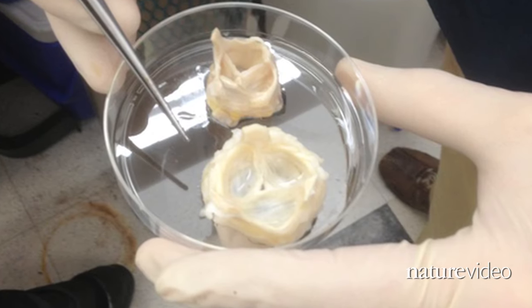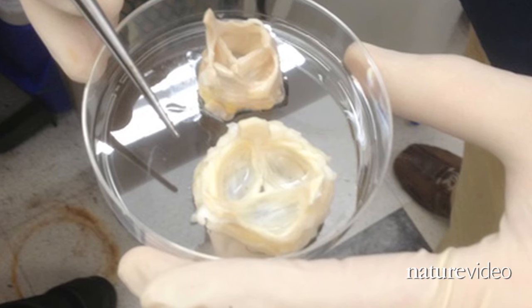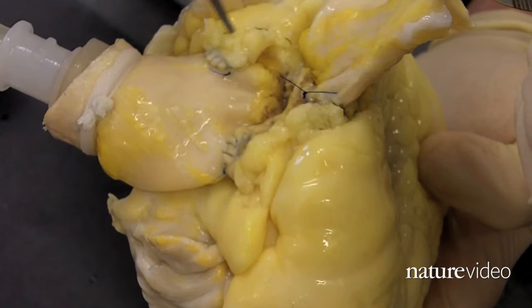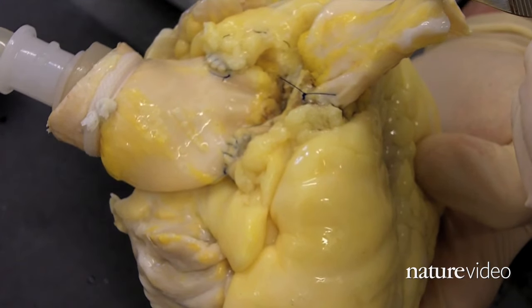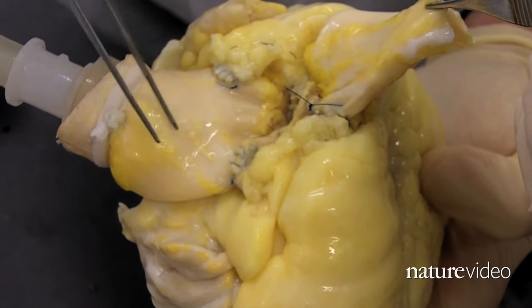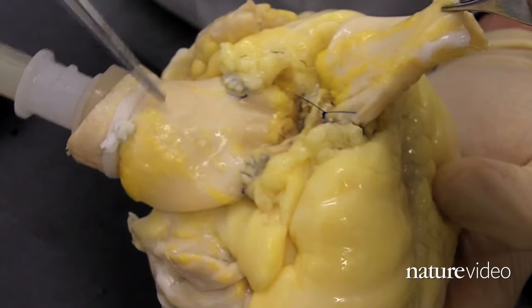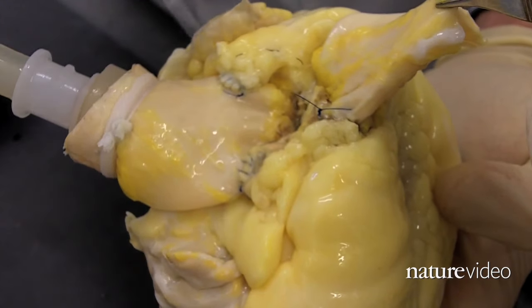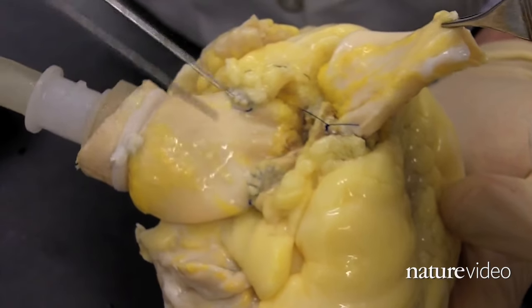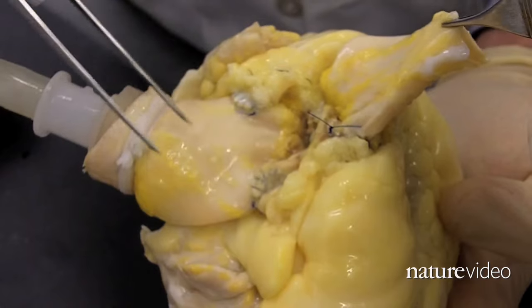They've taken a valve and part of the aorta from a decellularized heart and sewn it onto a cadaveric heart. This part here is the aortic root, including the aortic valve and the ascending aorta. This has been decellularized — a decellularized graft sewn onto a cadaveric human heart. You can see here the right coronary artery button and the left coronary artery button sewn onto that decellularized graft.